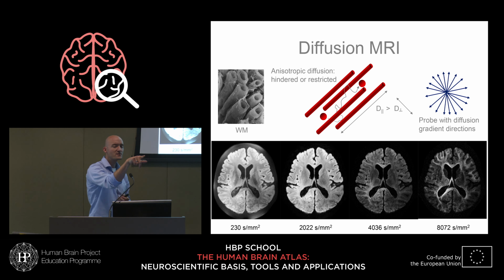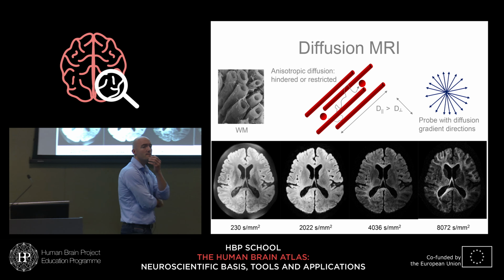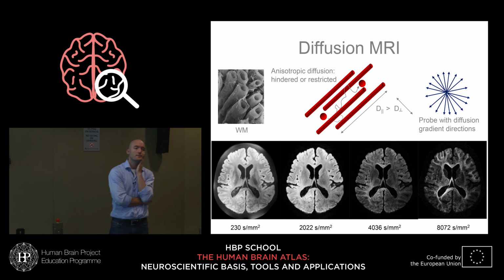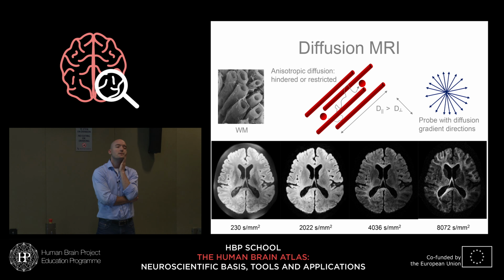That was another question that came up there. How do the preparation steps of ex vivo brains affect diffusion measurements? The short answer is very badly.